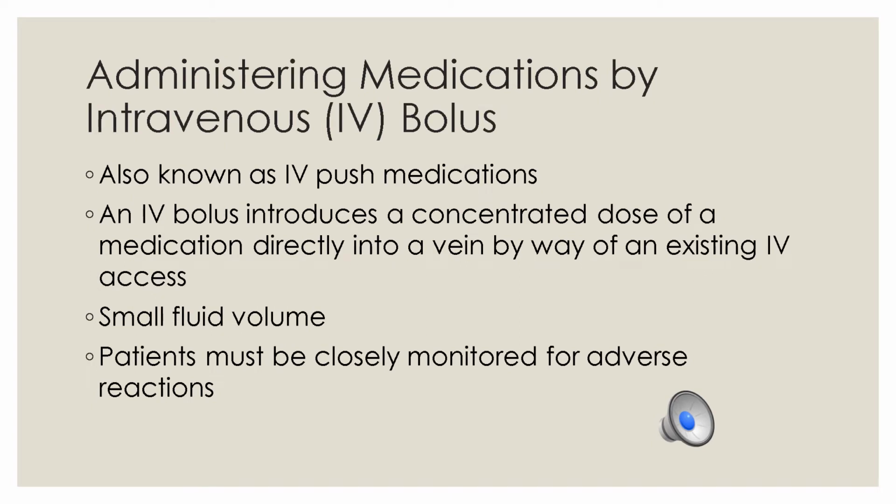Administering medications by IV bolus. It's also known as an IV push medication, so I may use that term throughout instead of IV bolus. It's a concentrated dose of a medication directly into a vein by way of an existing IV access. When you give them, an advantage is it's a small fluid volume given instead of a large amount to reduce the risk for fluid volume overload. There is no time to correct errors when giving an IV bolus medication because it is fast acting.